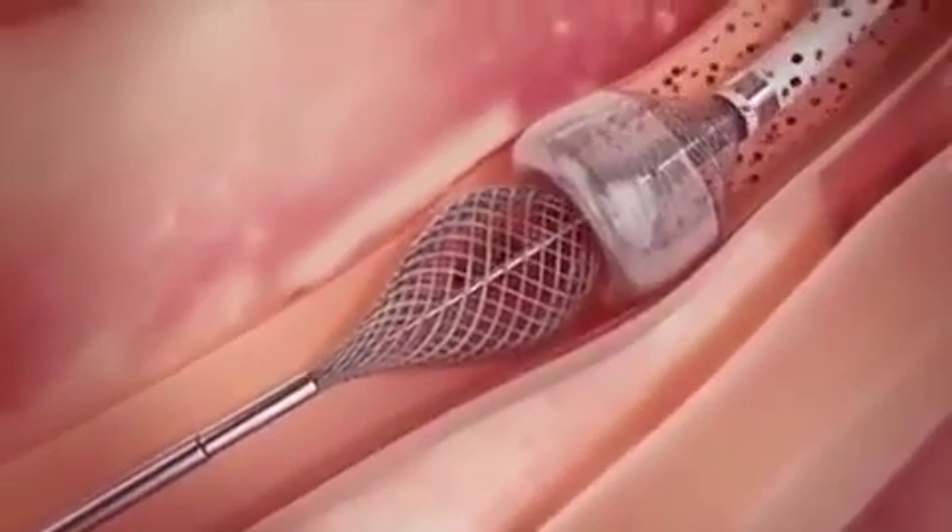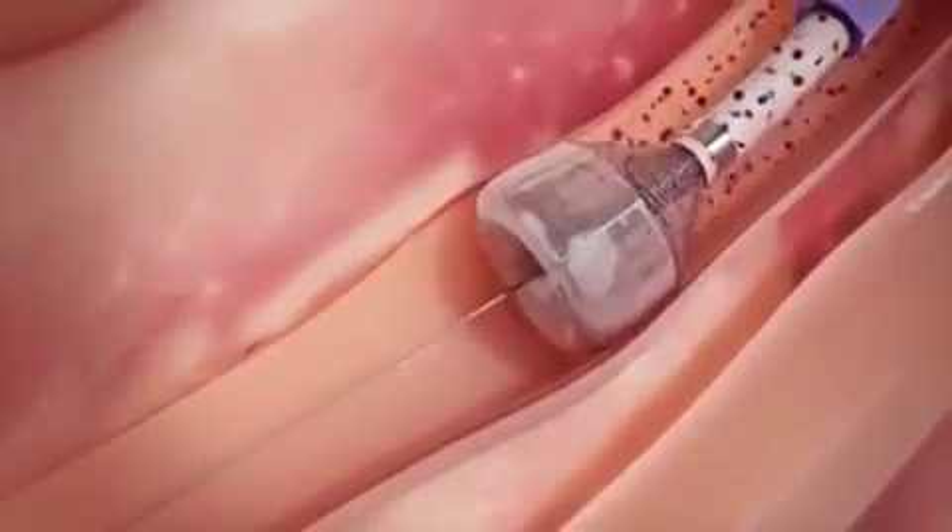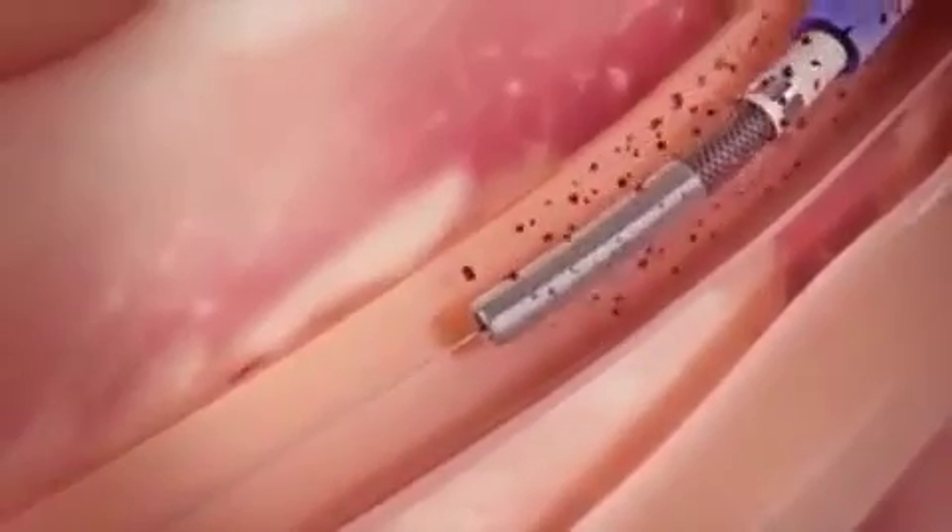After complete clot removal, suction is discontinued and the catheter tip is undeployed, restoring distal blood flow.